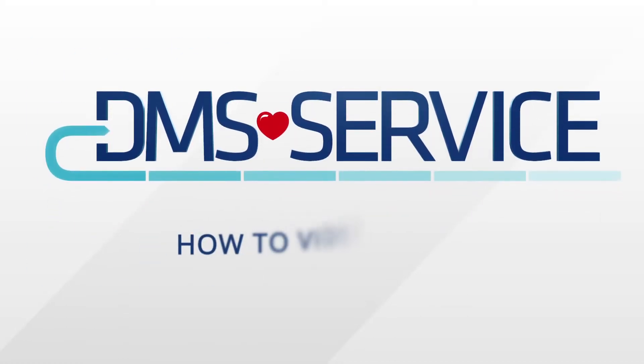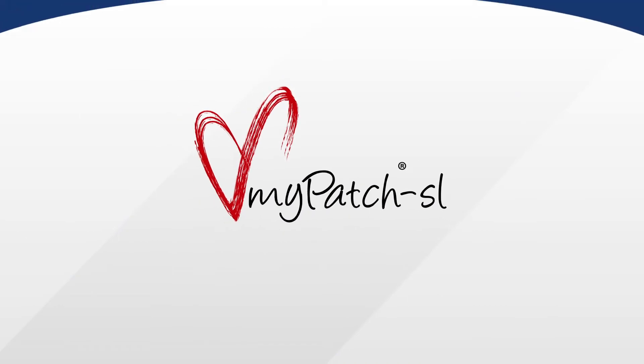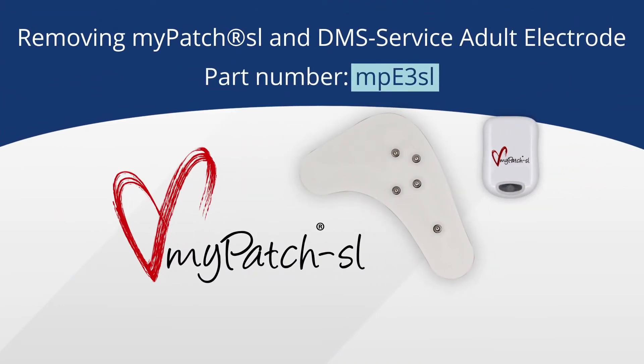DMS Service welcomes you to our how-to video series. In this video, we'll walk you through the simple steps of removing the MyPatch SL and the MyPatch SL Adult Electrode, which to confirm is part number MPE3SL.